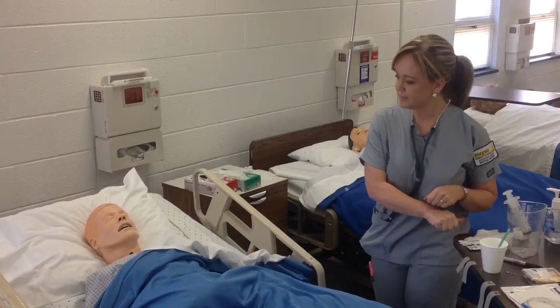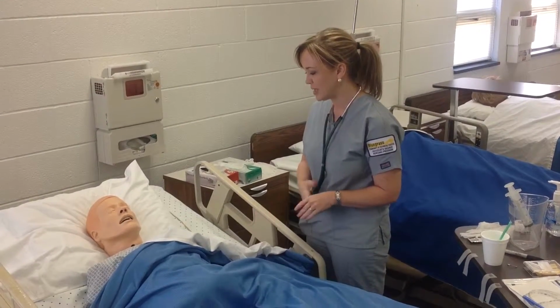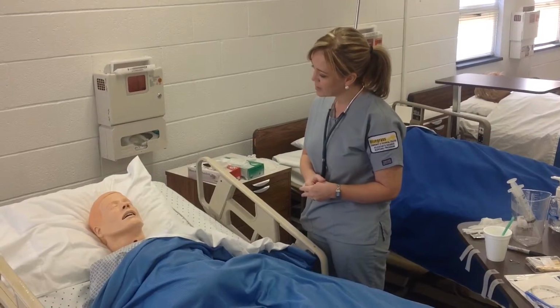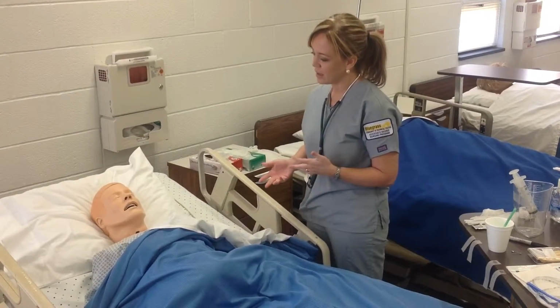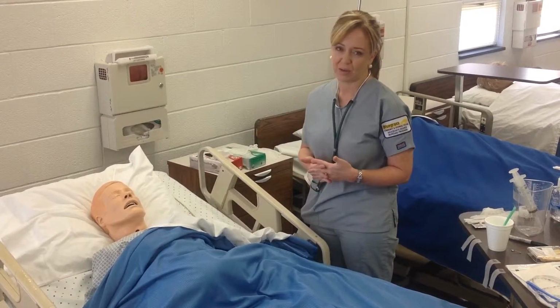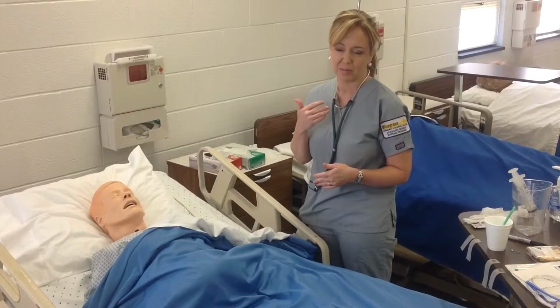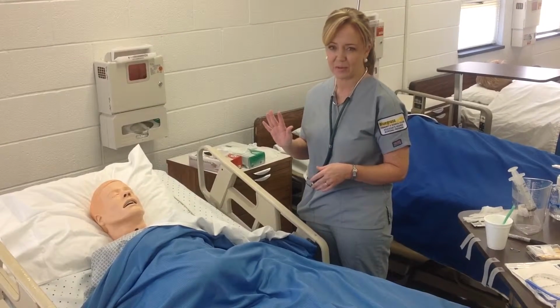So, hi Mr. Walker, my name is Samantha. I'm here to insert your NG tube today. Have you ever had this procedure? You have? Okay. So, I would explain my procedure to the patient, let him know that when the tube touches the pharynx area, he needs to establish a stop signal with me.